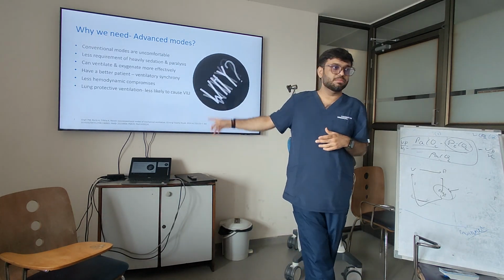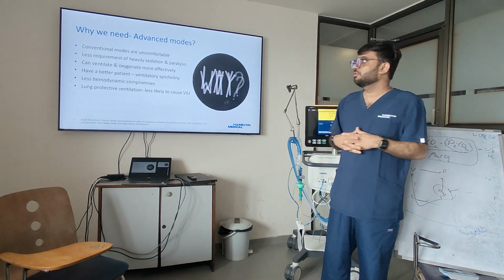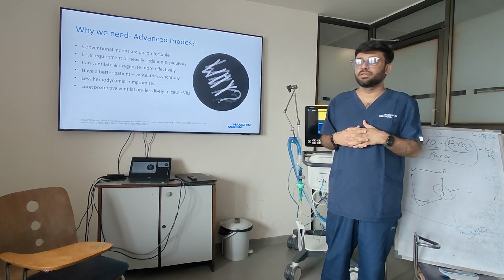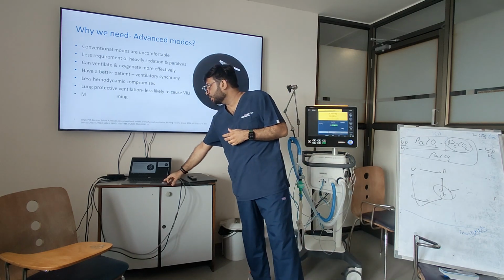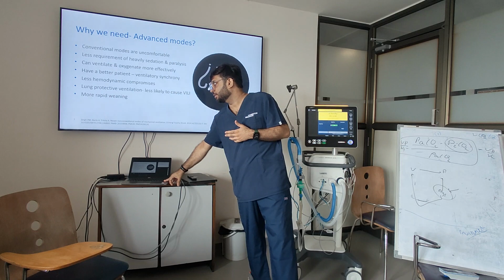The main part here is the lung protective ventilation, because it is going to change as per the patient's lung mechanics. There will be a much lower chance of ventilator-induced lung injury. So that is why the advanced mode is something really important to understand. And of course, with more rapid weaning, you have a shorter ICU stay.